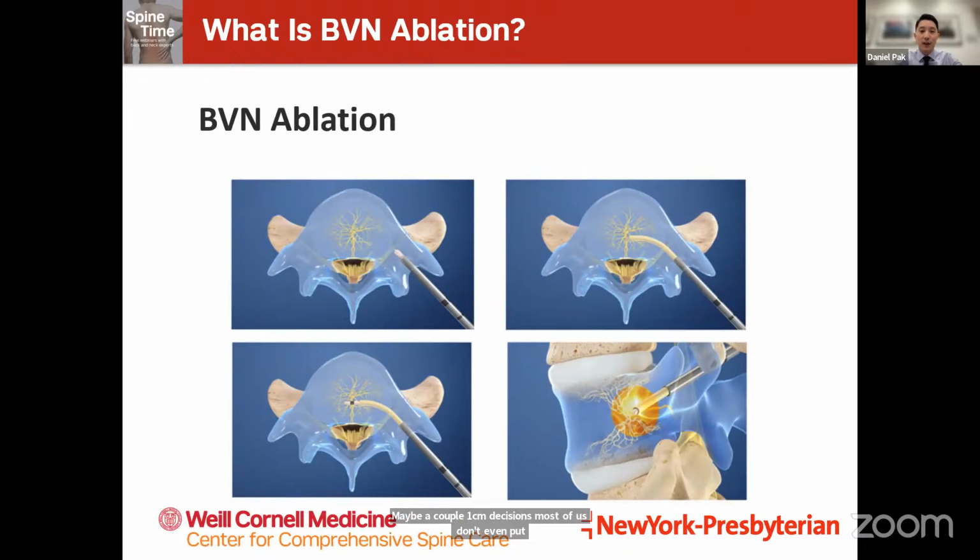And despite the fact that it sounds aggressive to put an instrument through the bone, it's actually not all that painful for a lot of people. So, for the recovery period, you might feel sore for a few days, but beyond that, it's really just elevating your level of activity as tolerated.